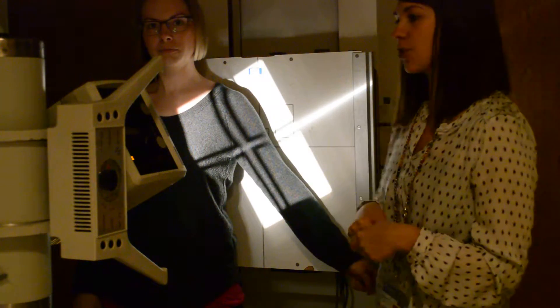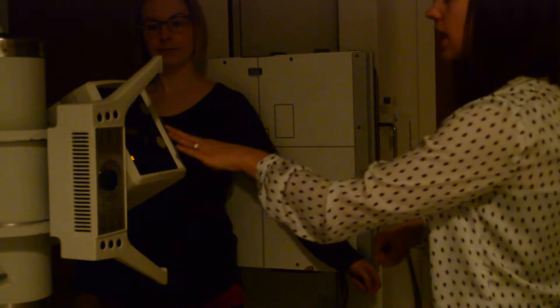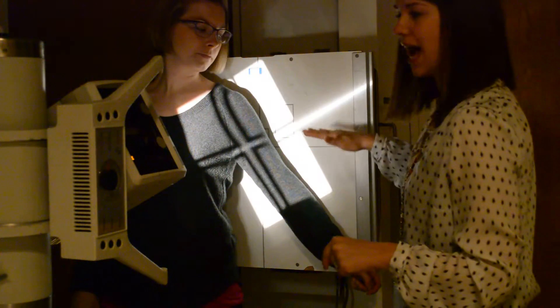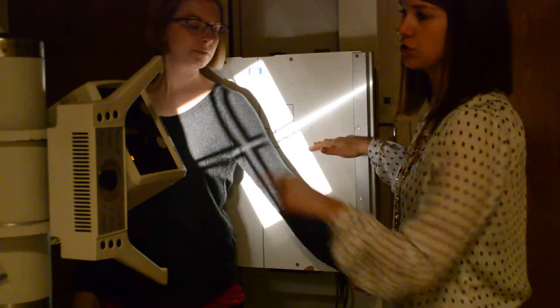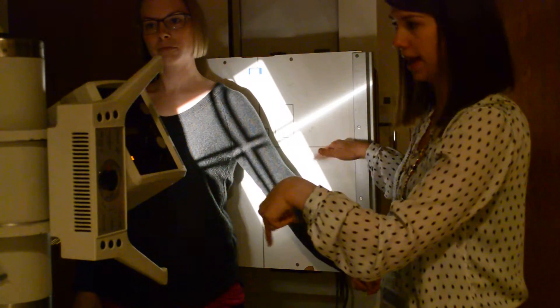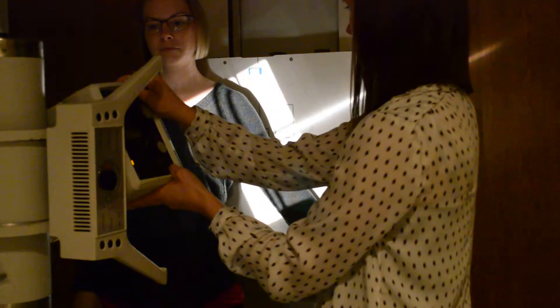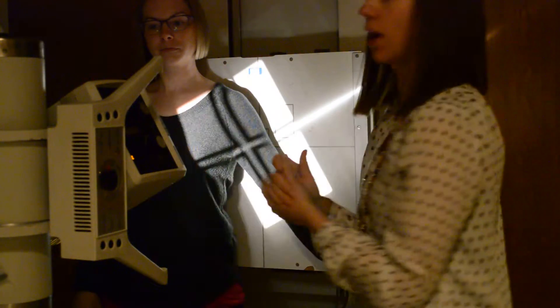Ask your patient to hold still and click. What I do want you guys to be mindful of is if you're going to turn the tube head, you have to have your bucky and your tube lined up before you turn your tube head. So I'm lined up and then I'm turning my tube head, just to make sure that you don't end up with any cutoff.